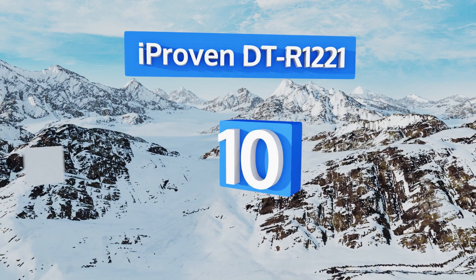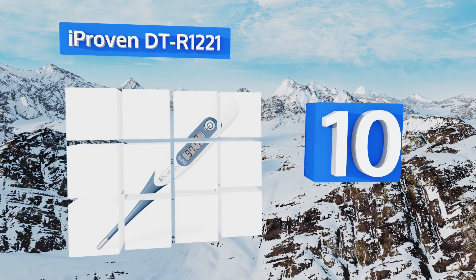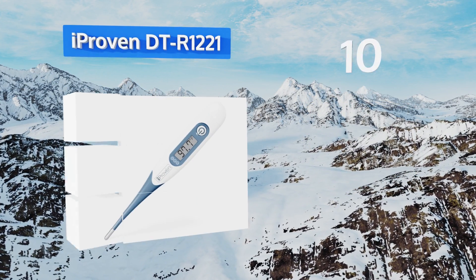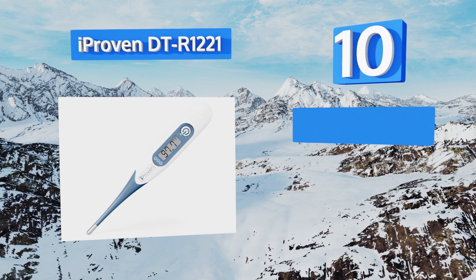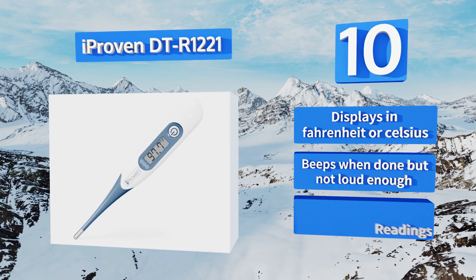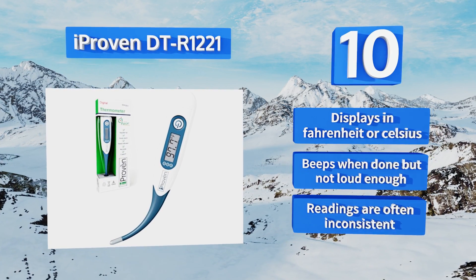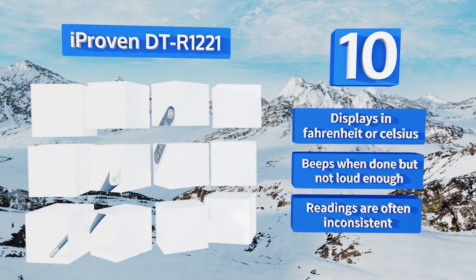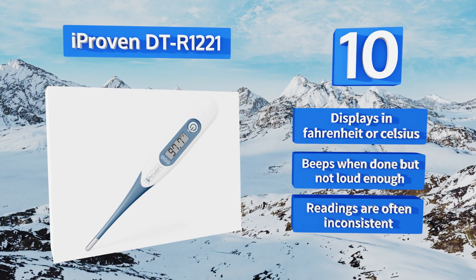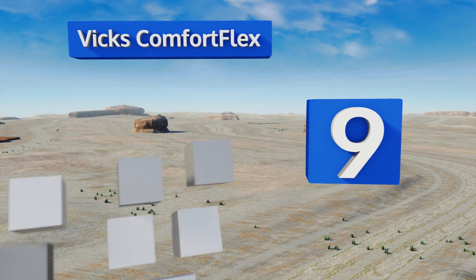Starting off our list at number 10, the iProven DTR1221 is inexpensive and versatile. The flexible tip enables oral, rectal, or axillary (armpit) usage, and whichever way you use it, you'll get a reading in 10 seconds or less. Despite its convenience, it's not very well made. It displays in Fahrenheit or Celsius and beeps when it's done, but not loudly enough.